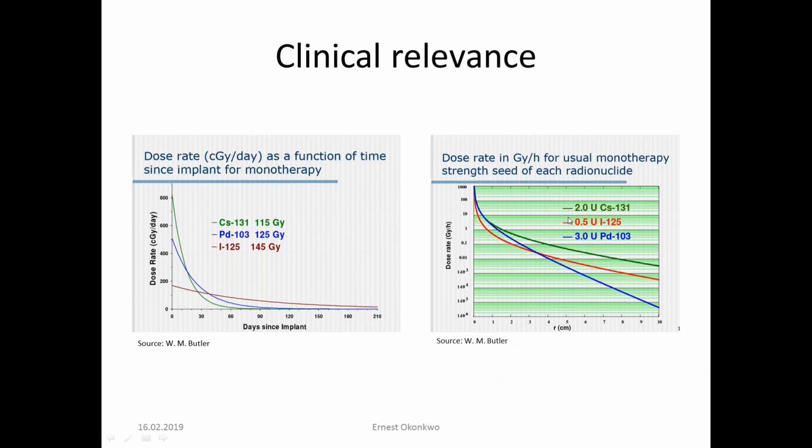This is another clinical relevance graphic. On your left, you have the dose rate as a function of time since the implant for monotherapy.